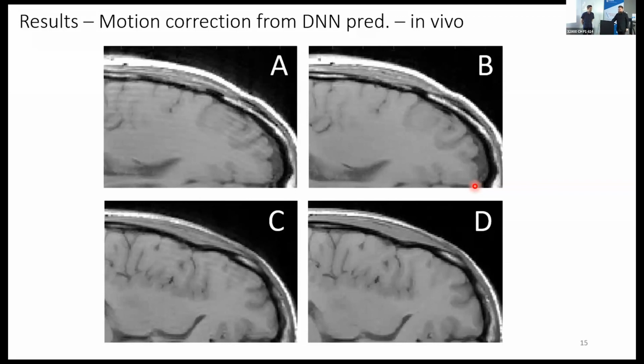I use the coil profiles, so it's a pointwise multiplication by the coil profiles estimated by eSPIRiT, and then there's a formula with a sum of squares, something like this, to reconstruct the final slice from all the coils. And in the training set, we have multiple different amounts of coils. It ranges from 16 to about 58. So it's a 64-channel coil, but with 58 coils, for example, all ranges of different amounts of coils.